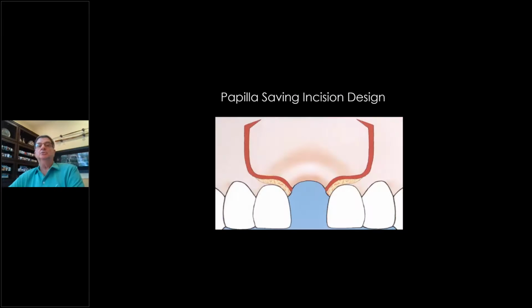Now here's something that I do. I know this is where maybe Dr. Elaskary and I disagree in some areas like this, but 98% of the time we're in the same place. But when I have to graft that buccal, if I have a healed ridge and the buccal is deficient, what do I do? I do not open the papilla to do mid-buccal augmentation or to place an implant.